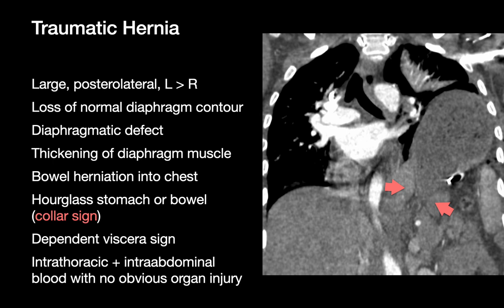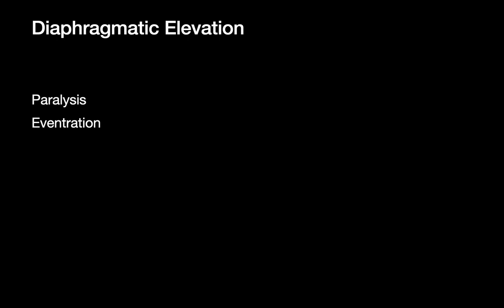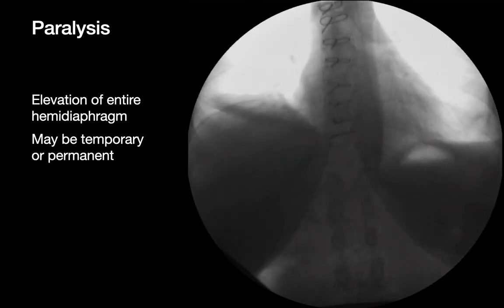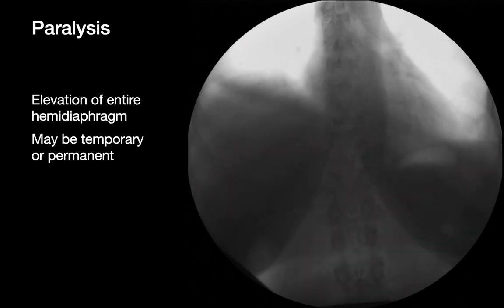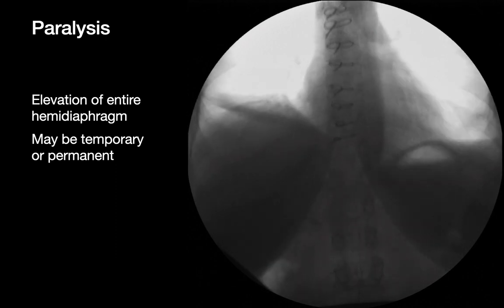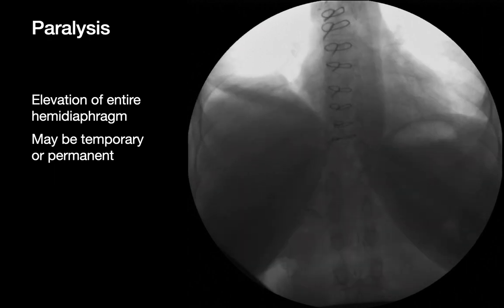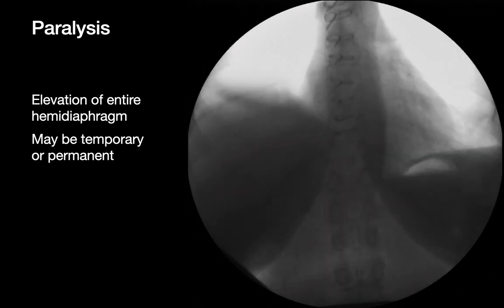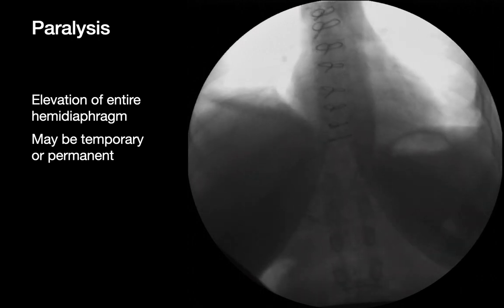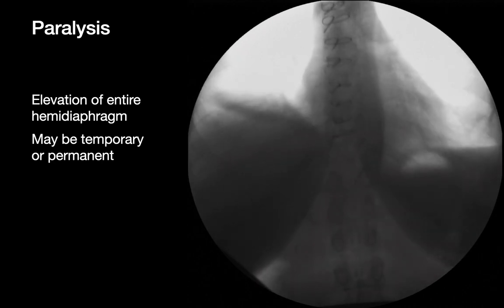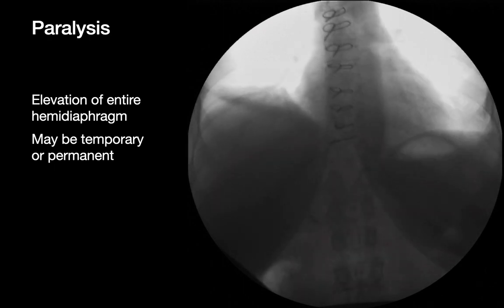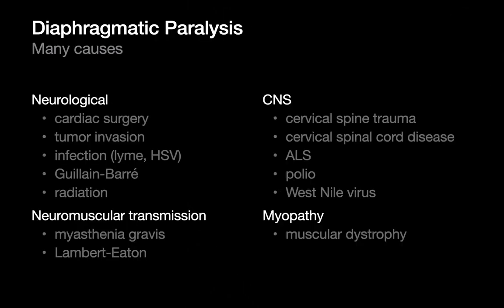Disorders of diaphragm elevation are usually due to paralysis or eventration. Paralysis will usually involve an entire hemidiaphragm on one side and can be either temporary or permanent. The typical diagnostic imaging finding is paradoxical motion of the paralyzed hemidiaphragm during forced inspiration or a sniff maneuver. On this fluoroscopy study, the paralyzed right hemidiaphragm is not only elevated but moves upwards while the normal left hemidiaphragm snaps downwards as the patient makes repeated sniffs. The most common cause of hemidiaphragm paralysis is generally phrenic nerve injury during surgery.